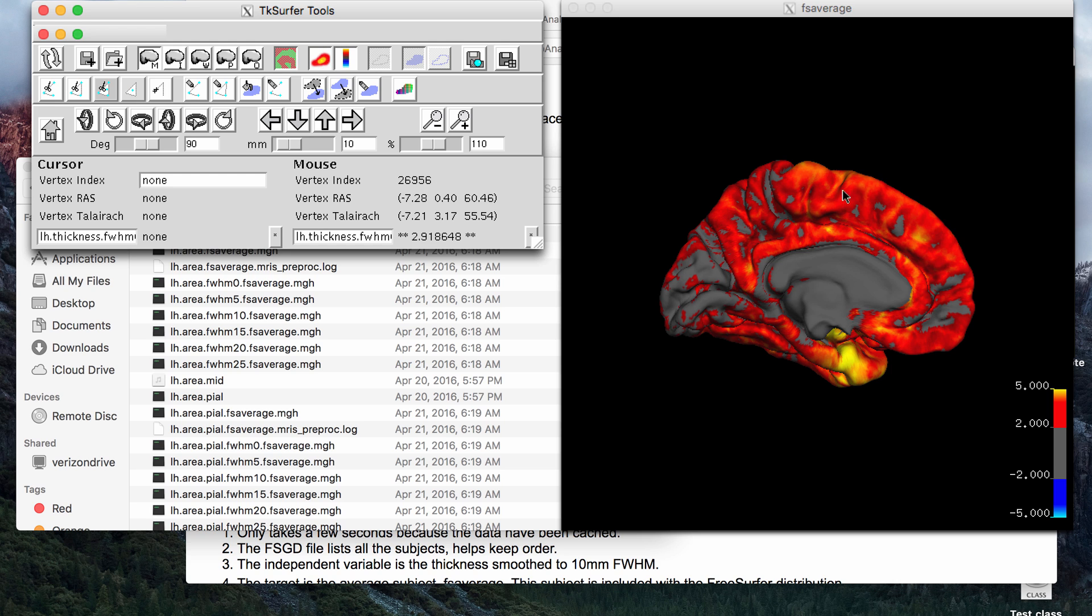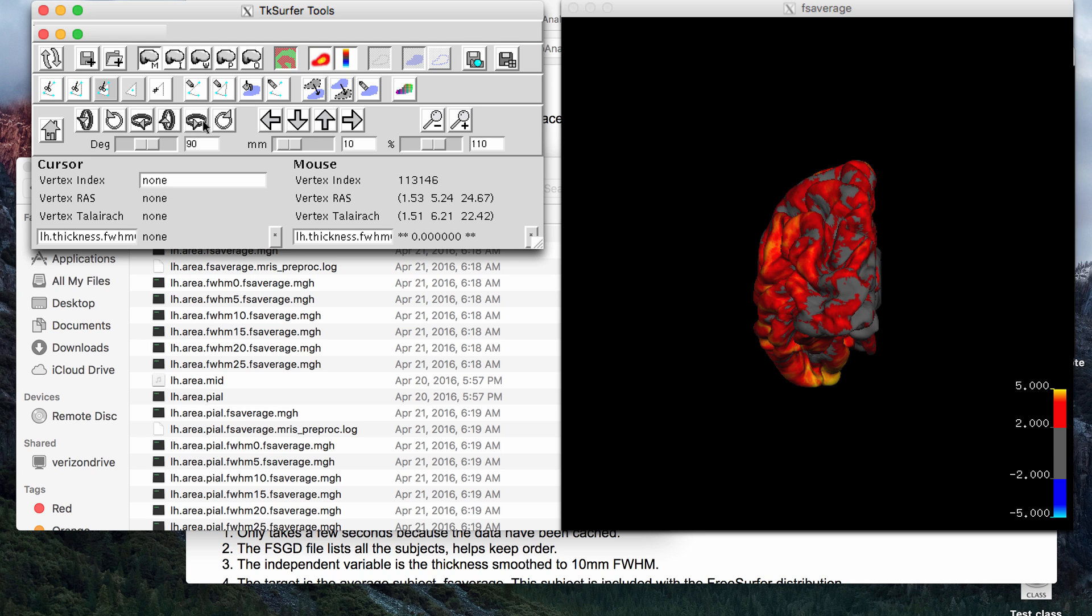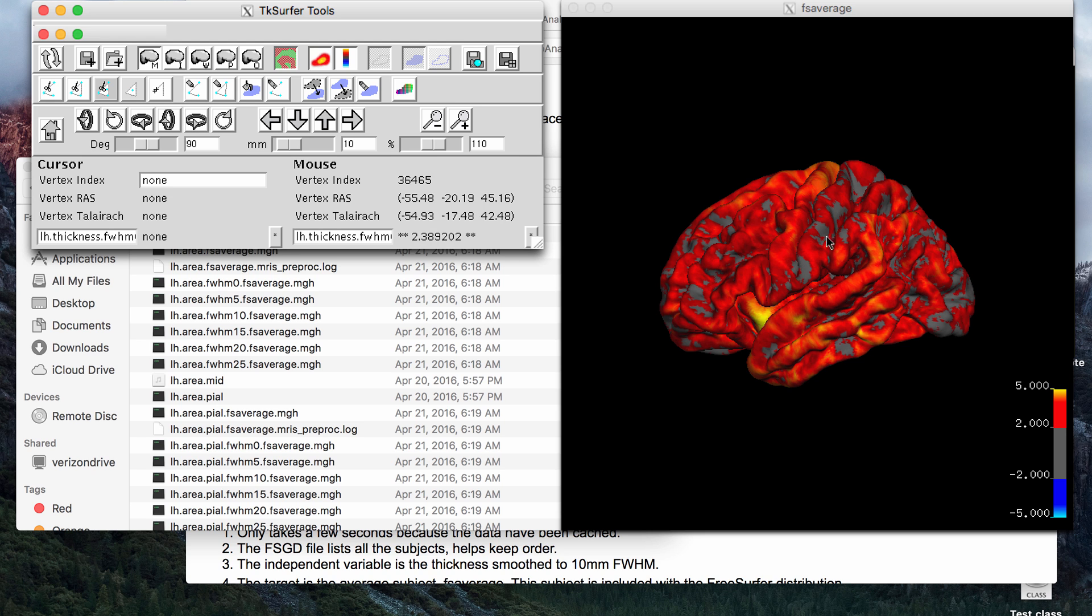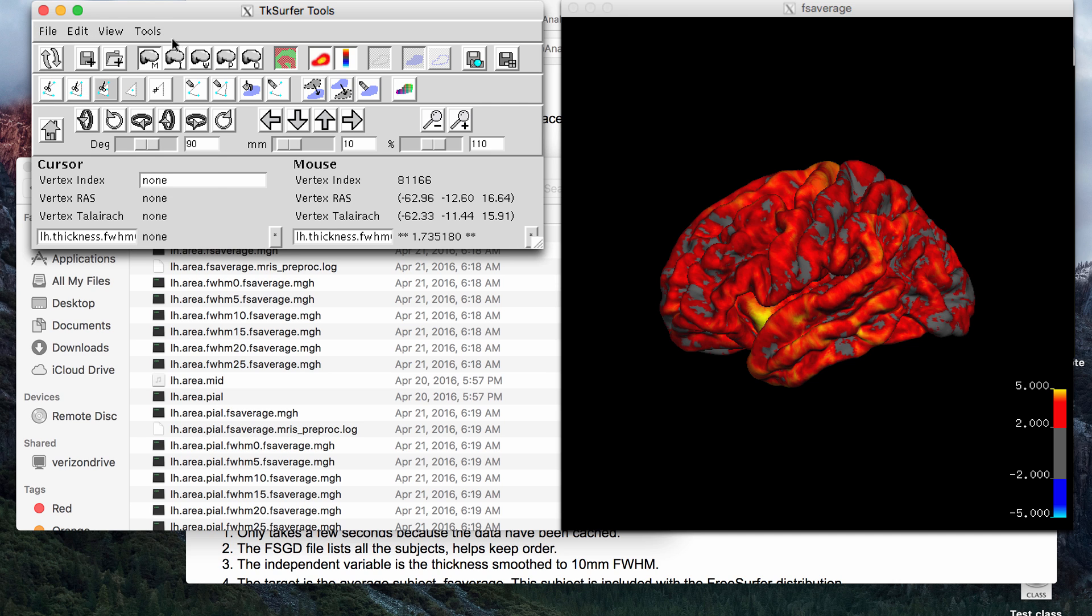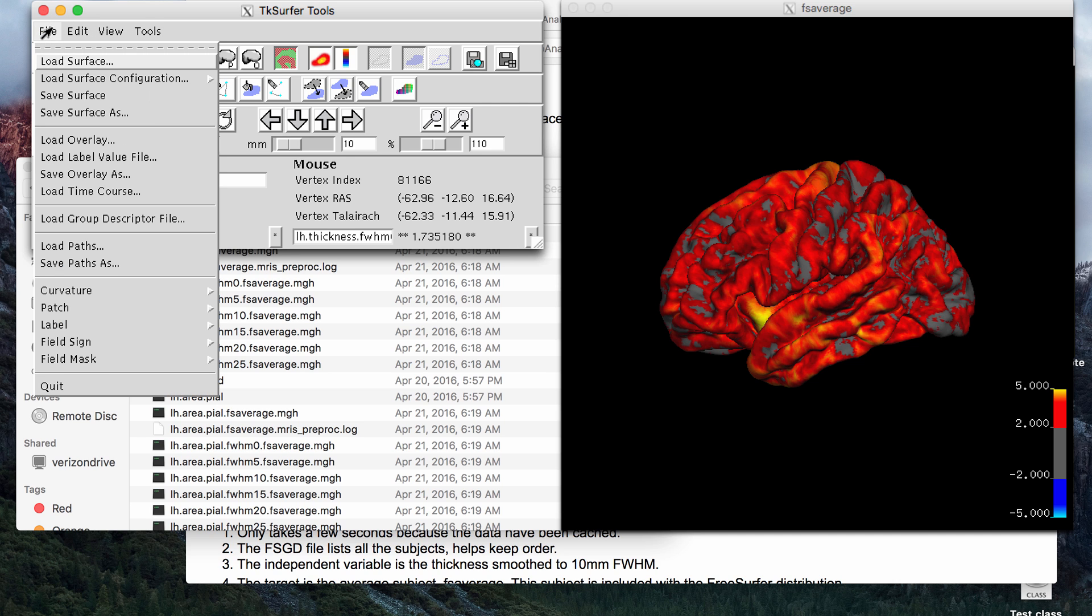And so if you create a z-map, you won't have as much of the brain lighting up. You'll just see like a small cluster here or there. So that's the idea with creating these maps.